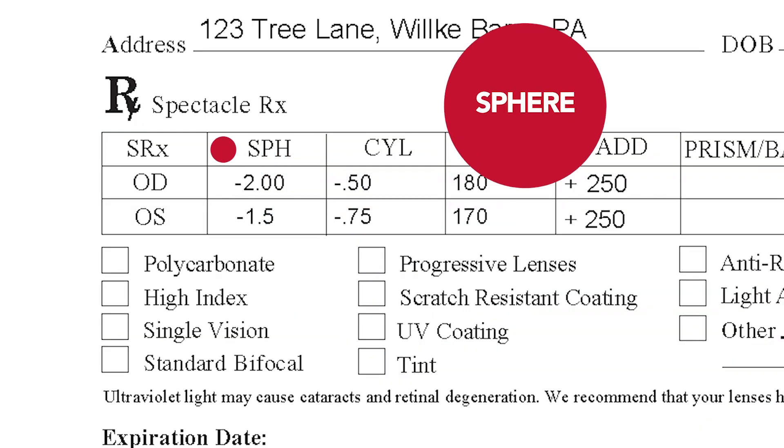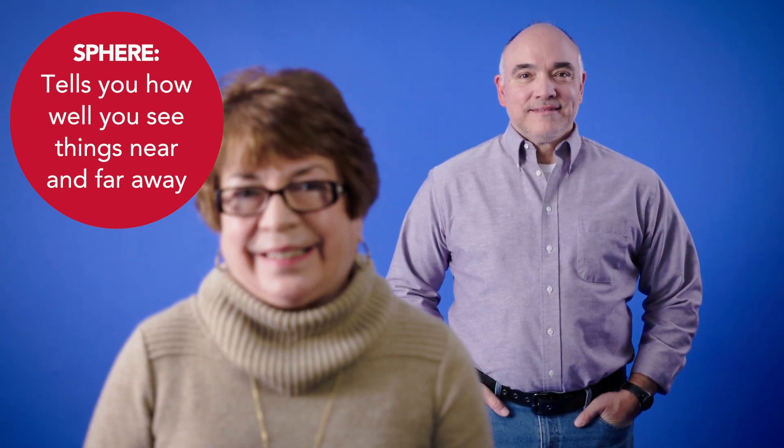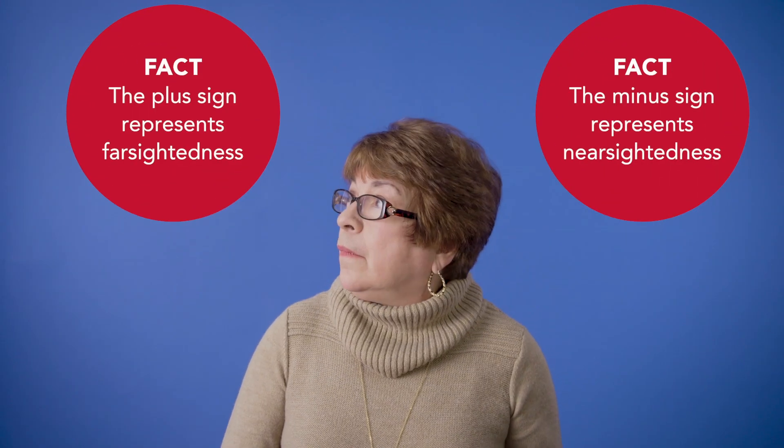Now take a look at SPH, which stands for sphere. The numbers in this column tell you how well you see objects up close and far away in each eye. The minus sign represents nearsightedness and the plus sign means farsightedness.